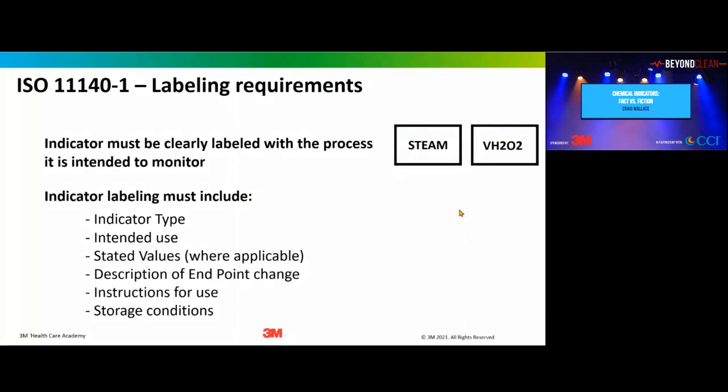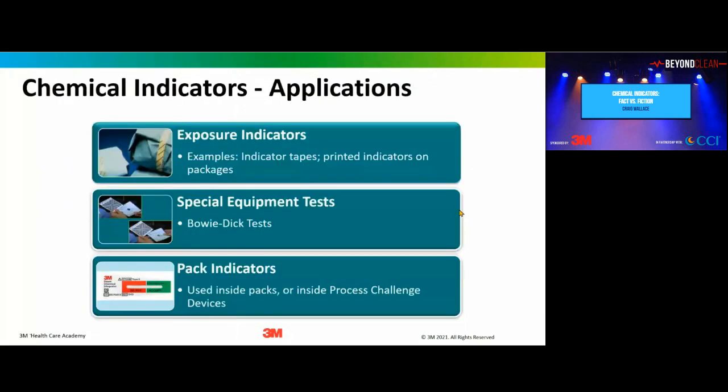Excuse me. So exposure indicators have different applications. I'm sorry, chemical indicators have different applications. They can be these exposure indicators or special equipment tests and pack indicators. So let's just take a quick swing through there and see what these things mean.